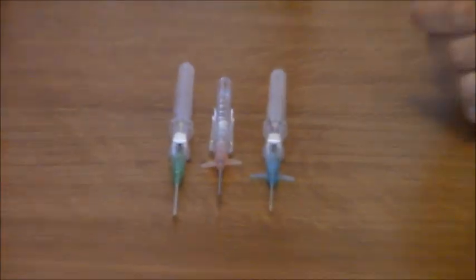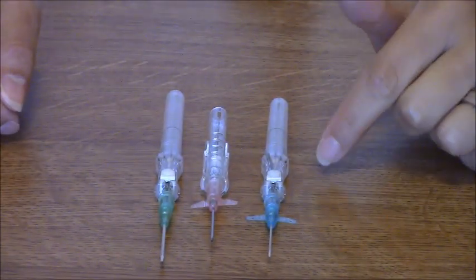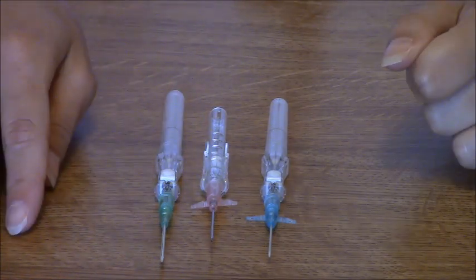Hey, this is Sarah with RegisterNurseRN.com and today I want to talk to you about the different IV gauges you'll be encountering in the hospital setting as a nurse. Right here I have the different types of IV gauges that you'll normally see. There is the 22 which is the blue one, the 20 gauge which is the pink one, and the 18 gauge which is the green one.